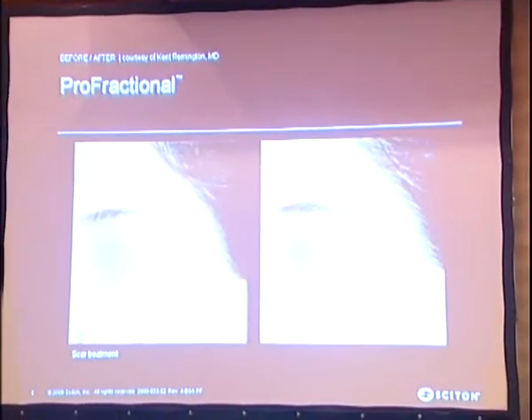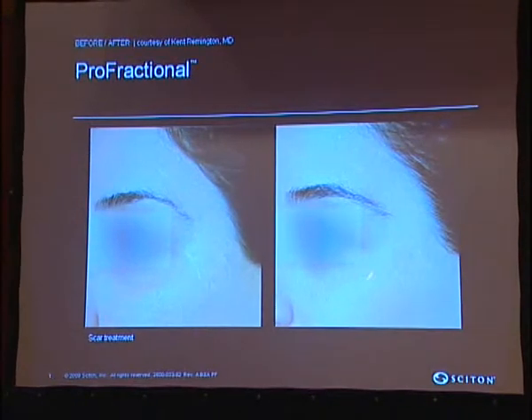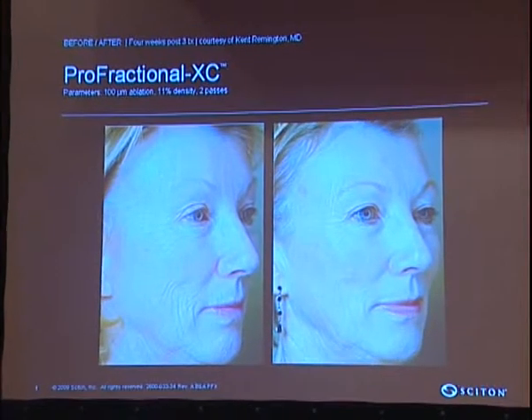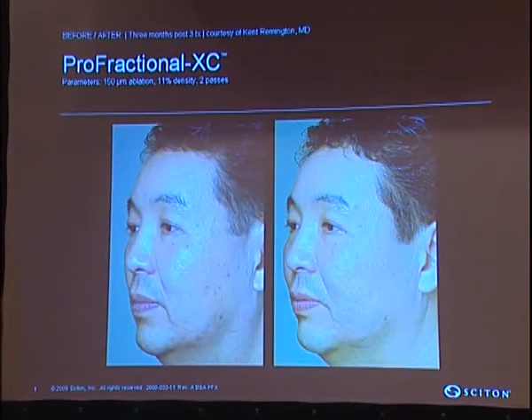Here also we can see good improvement in the texture. This is the pore size, and we can see the improvement in the pores. Texture, very good texture improvement as well. Scars can improve using the fractional laser. We have many cases of scars which improved nicely after using the fractional lasers.